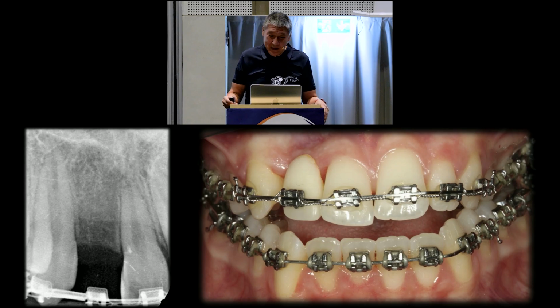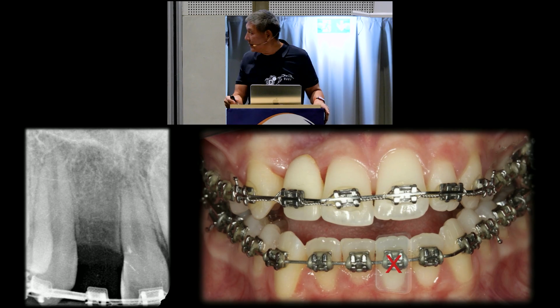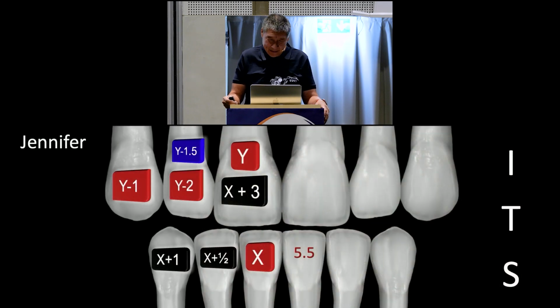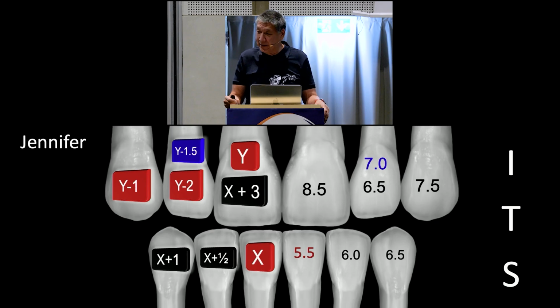They're not worn, and we can go through our algorithm, correct? And our algorithm will conform to the Bolton. So she has her lower incisor. It's not worn. We're going to measure the width. It's X. We add X plus 3 to our upper, and we get our Y value, and now we're back to our algorithm like this. Her lower central was, believe it or not, the mean average. So these are the numbers that should be for her other remaining teeth, and it should conform to Bolton.